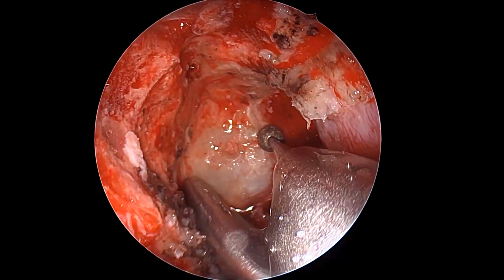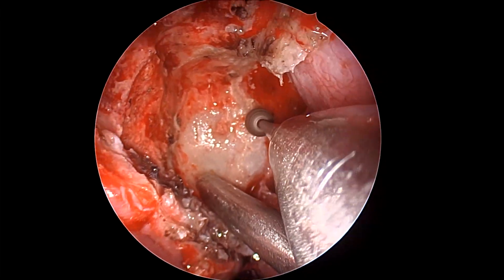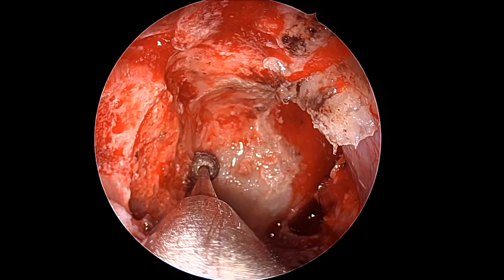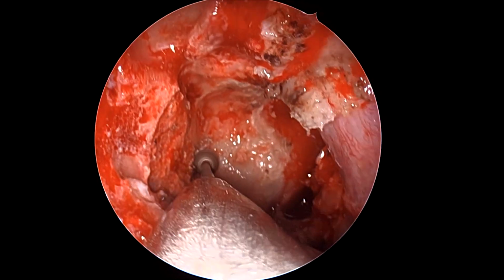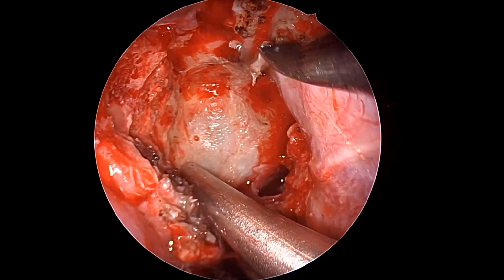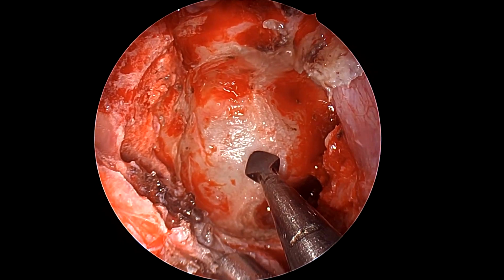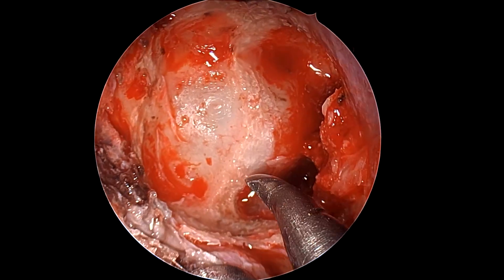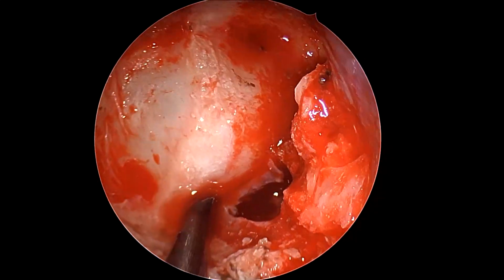Now, once we've done that, you see we're using a fine diamond burr to basically just thin down the sellar bone. We expose the floor of the sella. You can see that. So using the diamond burr to thin down the entire sellar bone in toto, not making very thick bone, because thin bone can be completely removed. In between, we use a simple blunt palpator or a blunt raspatory to keep feeling as to how thick the bone is that is still left.